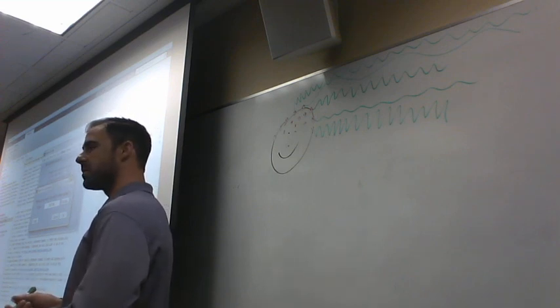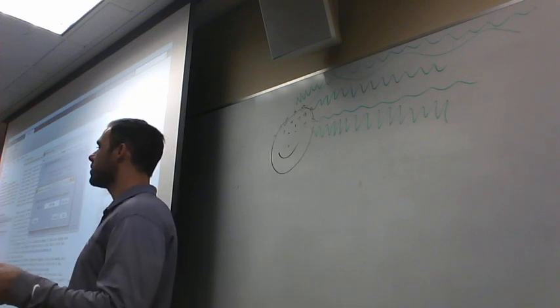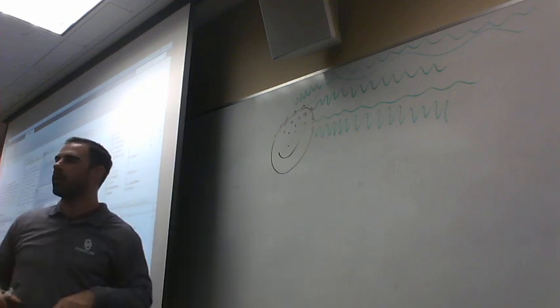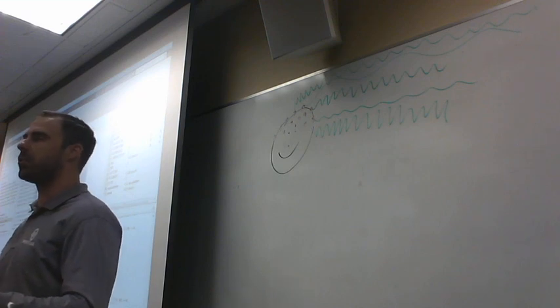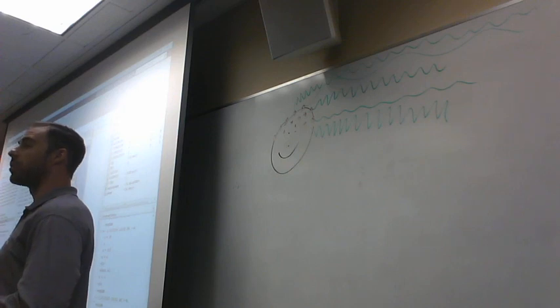You can use different sites to compare to, but for us, we record 2 additional electrode sites at what we call the mastoid site of the head. The mastoid is that bone right behind your ears. It's not the fleshy part by your neck. It's that weird bone that's back there. The idea is that it won't pick up as much brain activity directly. It'll pick up more non-neural activity. Now, people use different types of references.